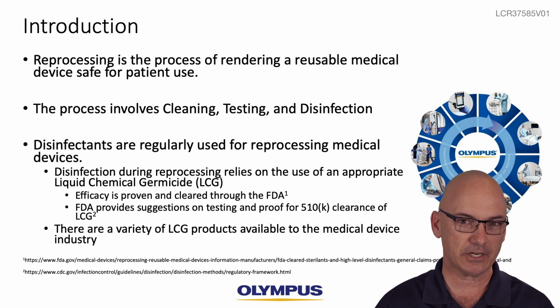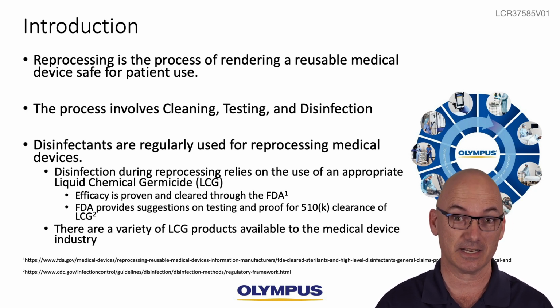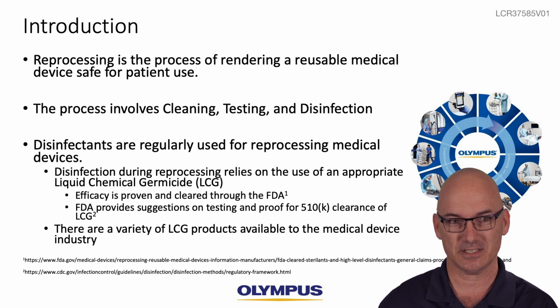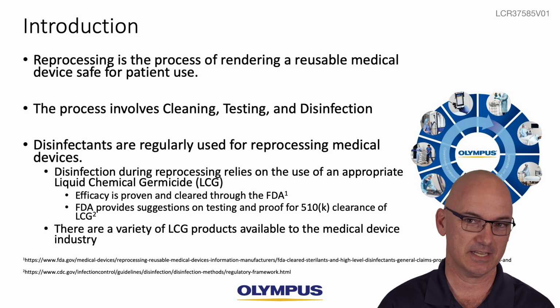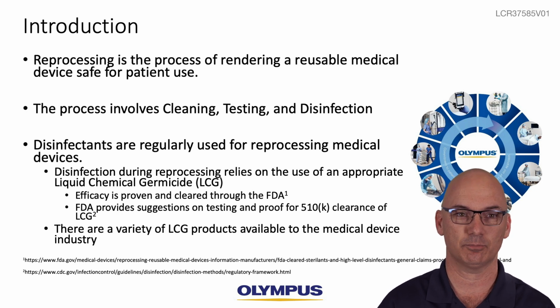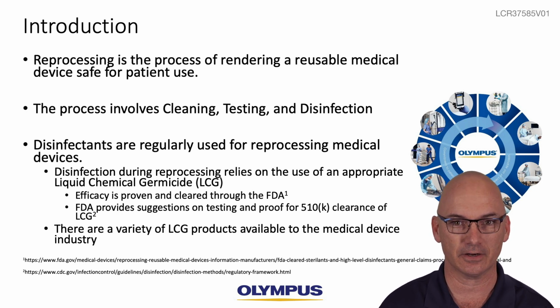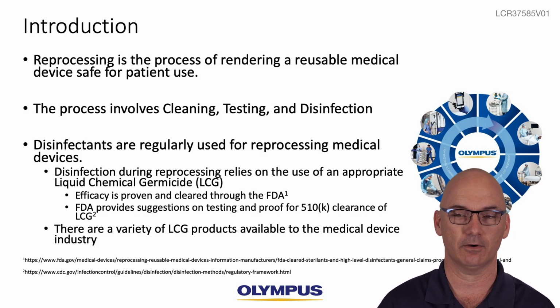And as part of the disinfection steps specifically, disinfectants are used to clean that device and to kill the microbes that are on it. Disinfectants are regularly used for reprocessing these medical devices, and they rely on the use of an appropriate liquid chemical germicide for that step. Efficacy is proven and cleared through the Food and Drug Administration, which provides suggestions on testing and proof for the 510K clearance of that disinfectant and that LCG for use.